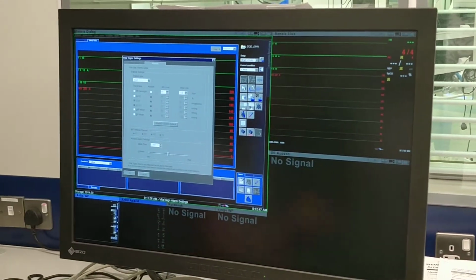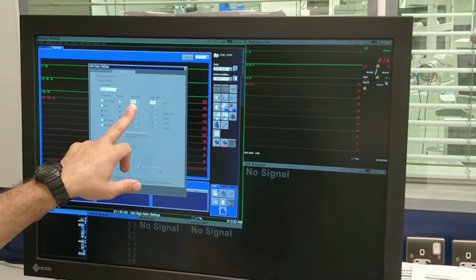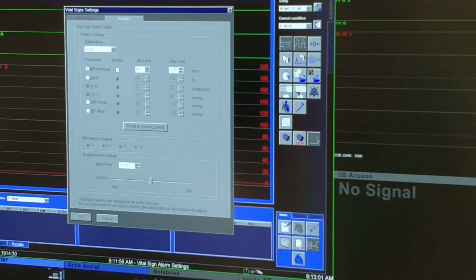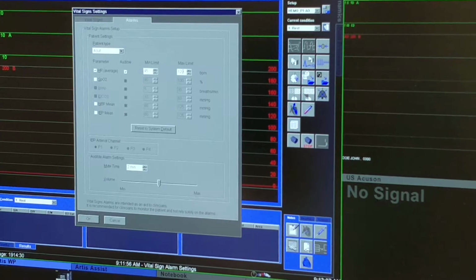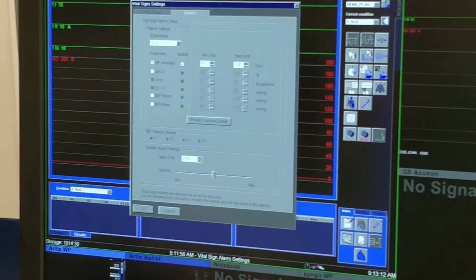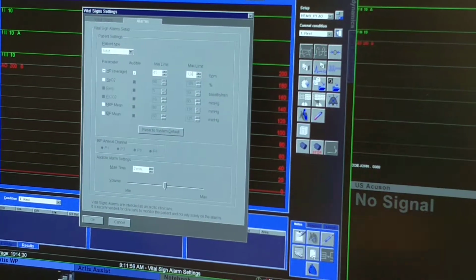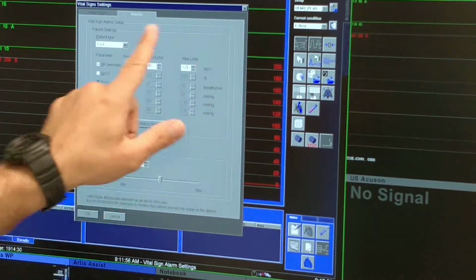If the patient comes and you know the baseline heart rate is 55, is 45 minimum good or not? Yeah, it's good as an alarm. If the patient's baseline heart rate is 55, and I put the alarm at 60, what happens? Always alarm. Bang, bang, bang, bang. Everybody goes bang, bang. So, how about 120? Are you happy? Tachy. But is it a good alarm limit? Yeah, good. Why is it good? Because above 120 for an adult, there is really something wrong, okay? And it starts alarming. So you set your alarms, okay?